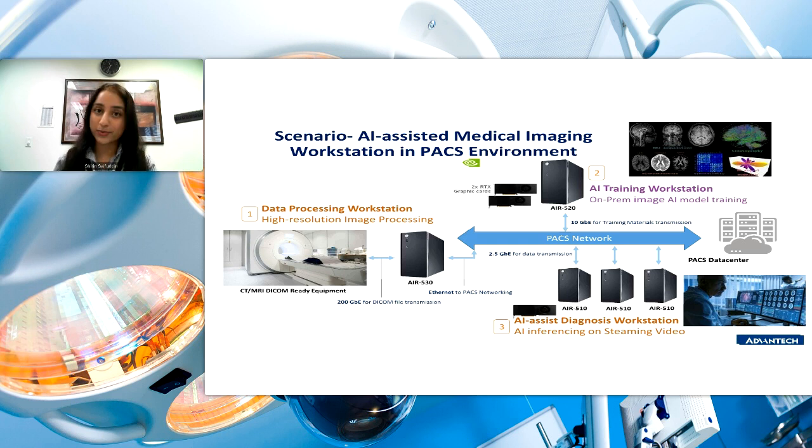Let's speak to this specific scenario. So here we see a scenario in which edge servers can live on various points in the PACS network to facilitate AI assistance in the medical imaging workstation.